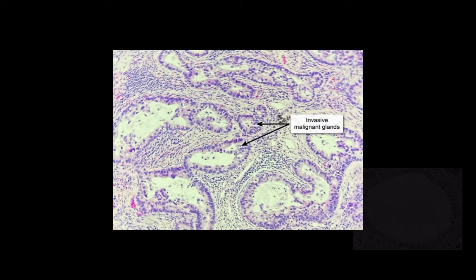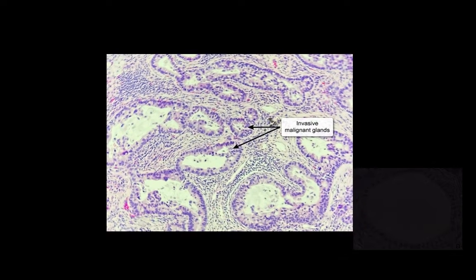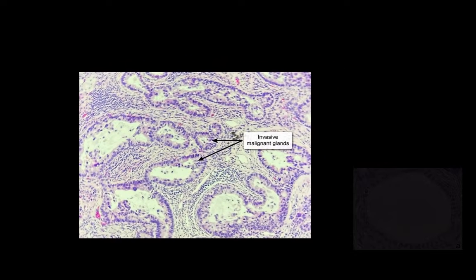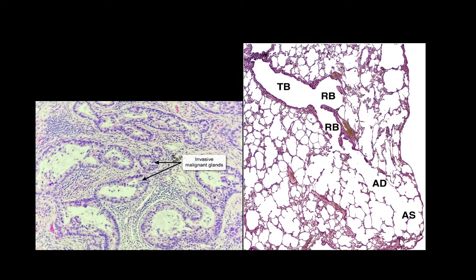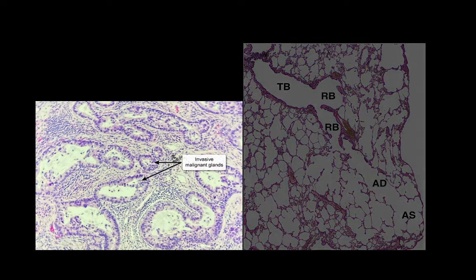This adenocarcinoma may not be easily identified as lung tissue, due to the invasive property and the advanced stage of the cancer. Look at the normal lung histology: we have terminal bronchioles, respiratory bronchioles, alveolar ducts, and alveolar sacs. We have air spaces that look empty, separated by alveolar septae.